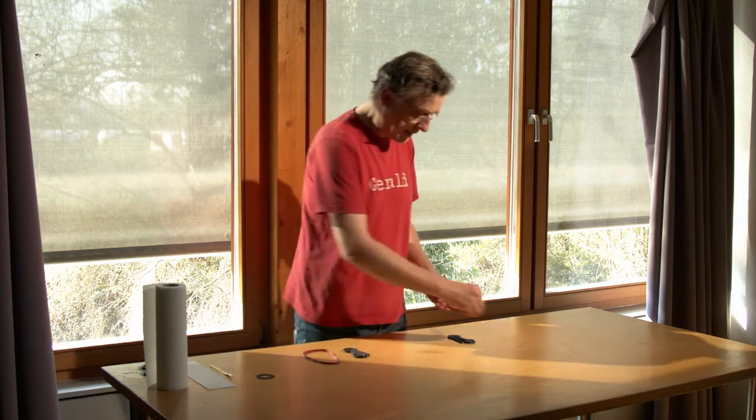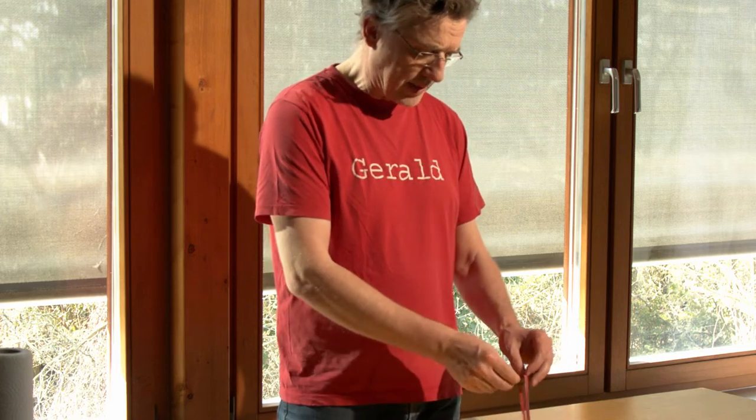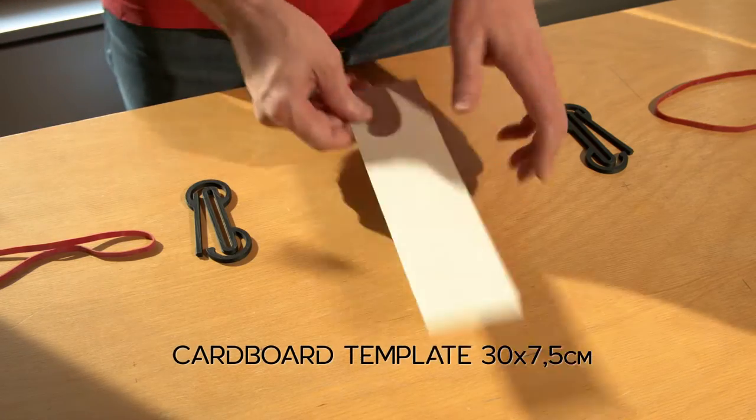For folding the actual filter of the mask, we are going to need a cardboard positioning help of 30 x 7.5 cm.